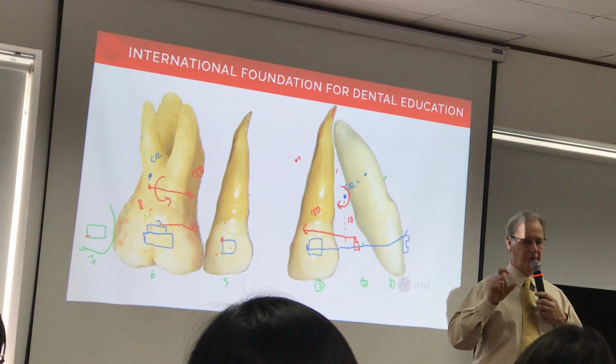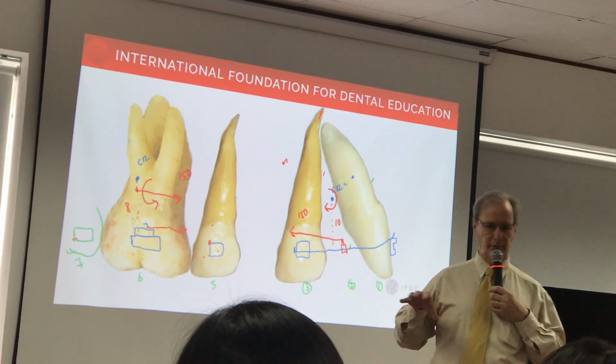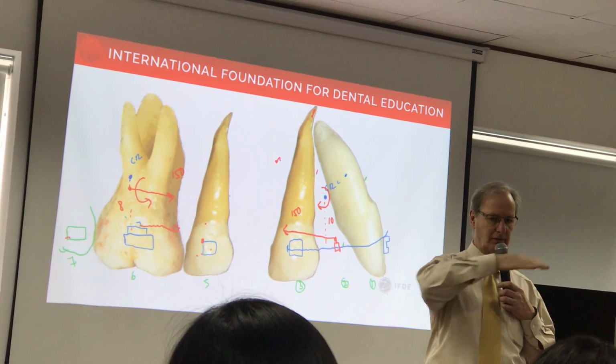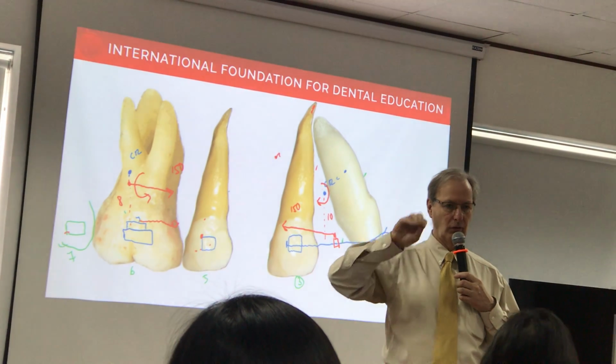So the thing is that the deal, which people don't get, especially in Vietnam, that's why I'm pushing a lot of this, is you better use a bigger wire with less curve than a smaller one with big curve. Because you find a whole lot less.